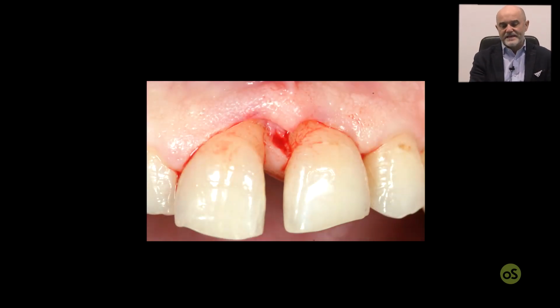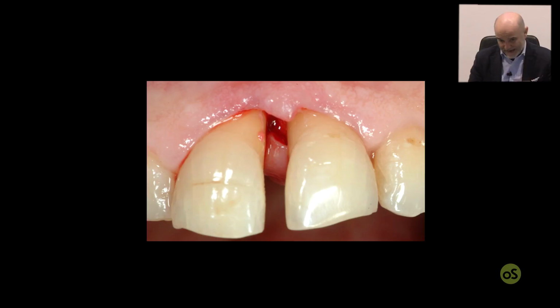Minimally invasive means that you only open one papilla, that is the one of the defect, and you only move the supracrestal soft tissue in the palatal aspect and get it free from the granulation tissue without any opening of the adjacent teeth and adjacent papilla.